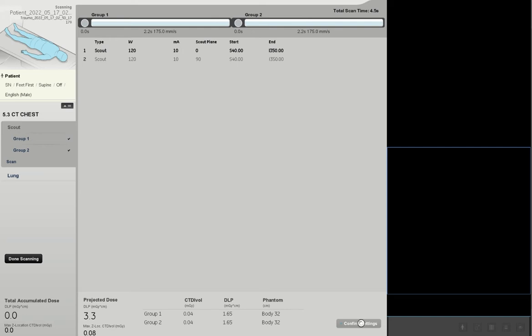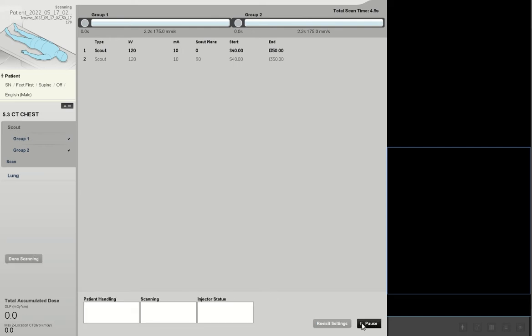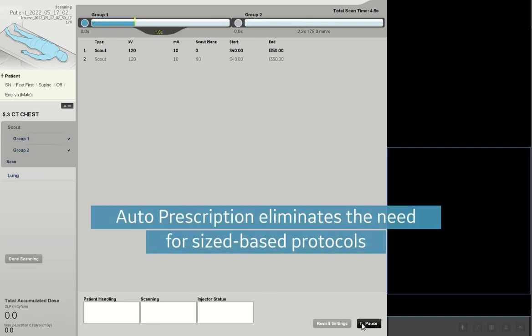Auto prescription, an element of effortless workflow, helps to eliminate the need to utilize size-based protocols in CT scanning.